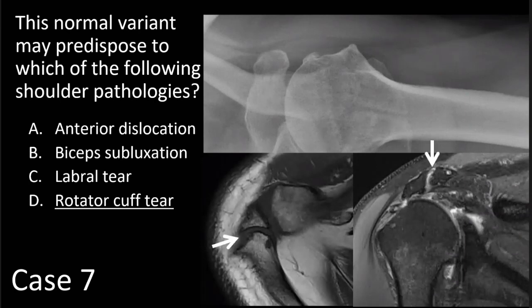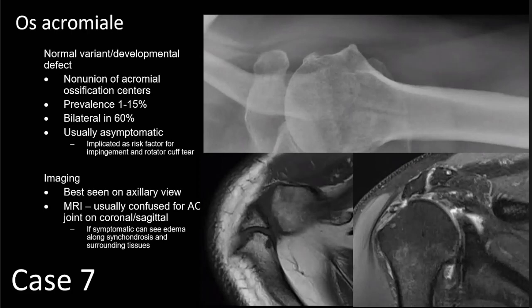This patient has os acromiale — an older patient with degenerative change who also has a full thickness rotator cuff tear on the coronal view. Os acromiale is a normal variant characterized by non-union of the acromial ossification centers. It has a published prevalence ranging between 1% and 15%, is bilateral in 60% of patients, and is usually asymptomatic, although it has been implicated as a risk factor for impingement and rotator cuff tear. It's best seen radiographically on the axillary view, and it's important to closely evaluate axial sequences because it can be confused for the acromioclavicular joint on coronal and sagittal sequences.